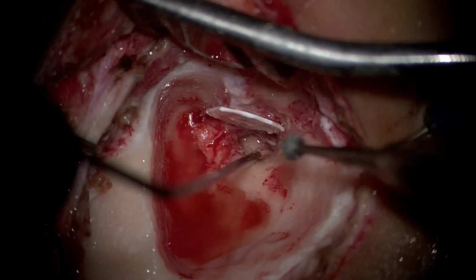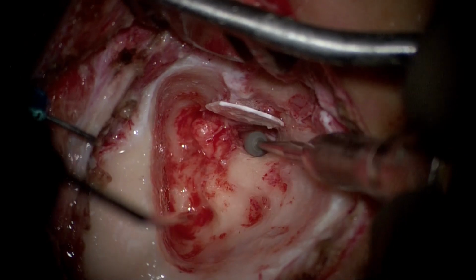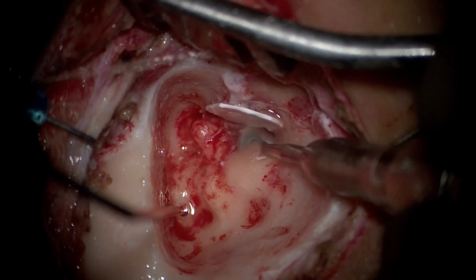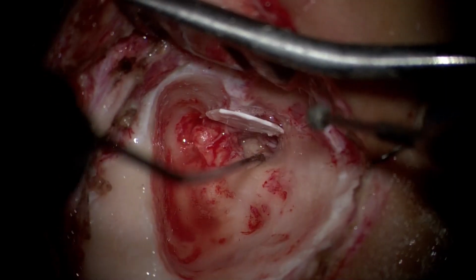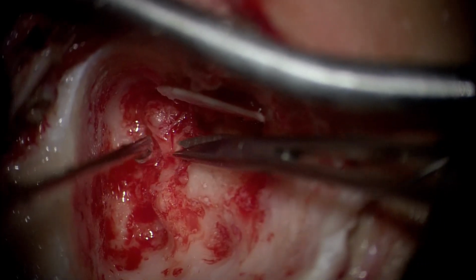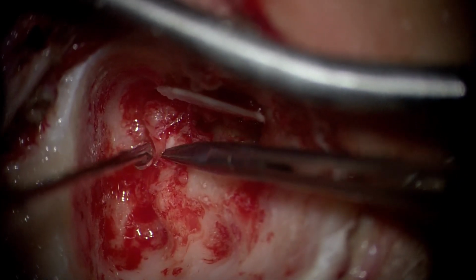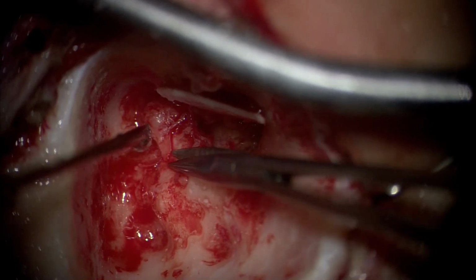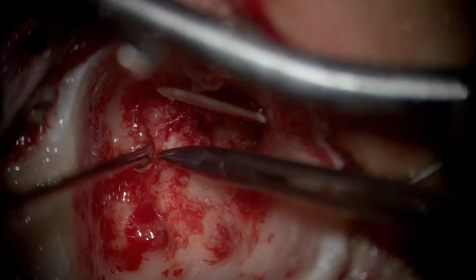to the mastoid segment. Now, this particular part of surgery, obviously, ignites a lot of fear in the younger colleagues, and that is why we also see a lot of disease remnant and residual cholesteatoma in this portion of surgery. You have the lateral semicircular canal, you have the facial nerve, and you have the stapes.